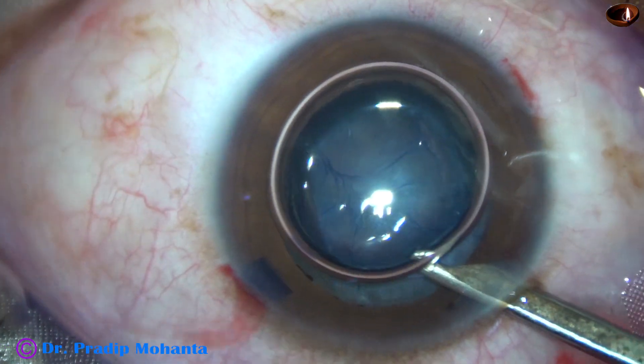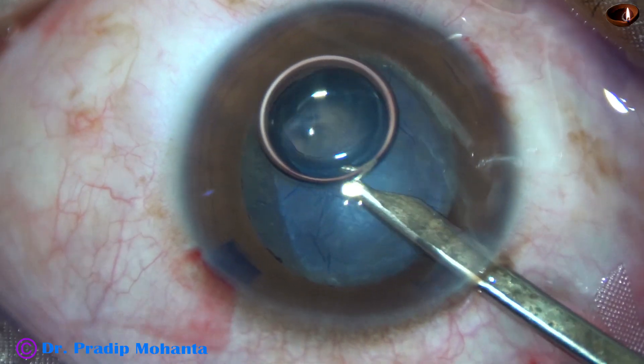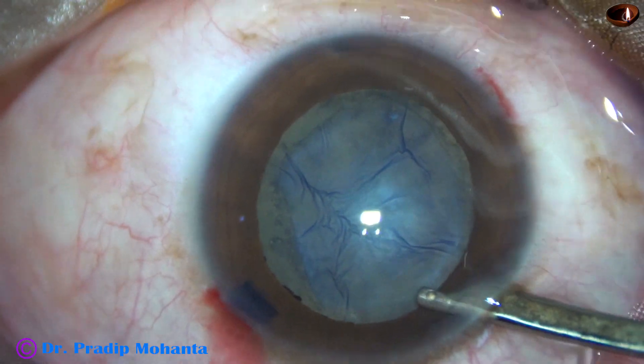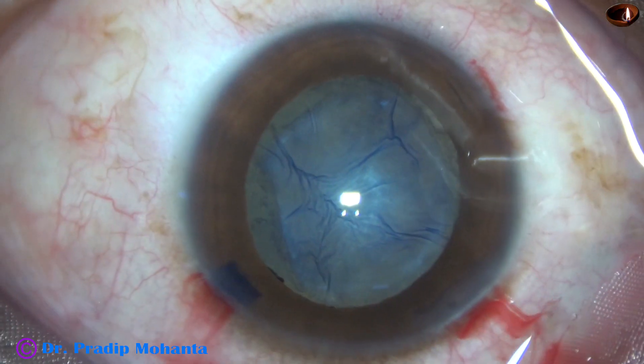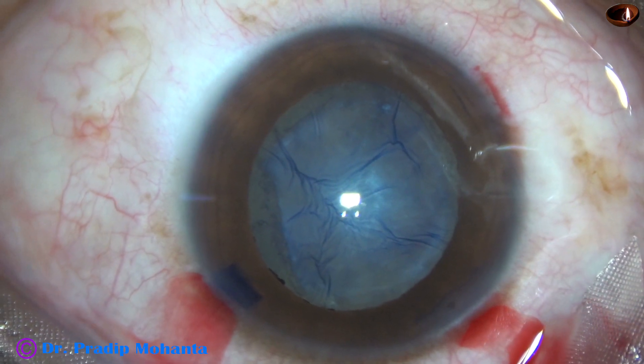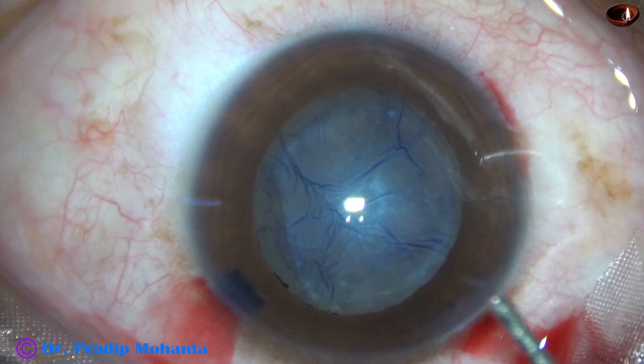My plan is to try to do a rexis of about 5 mm, but watch the extension of the fibrous tissue — it is more than 6 mm.